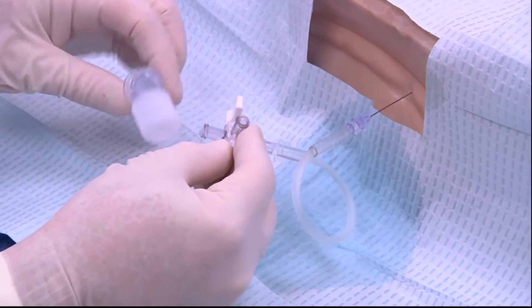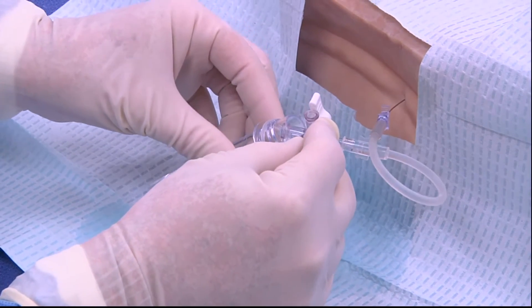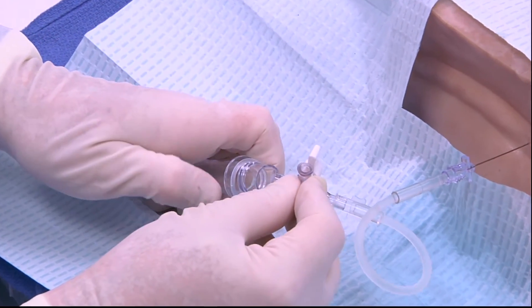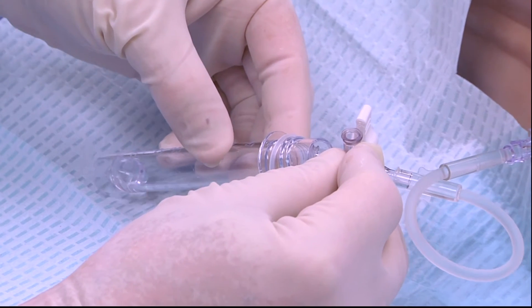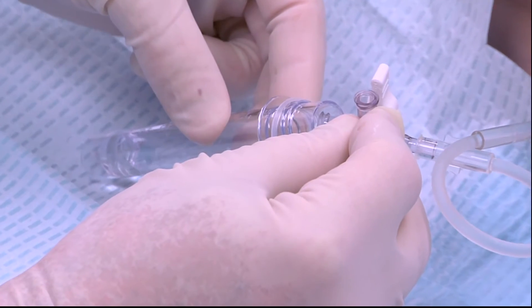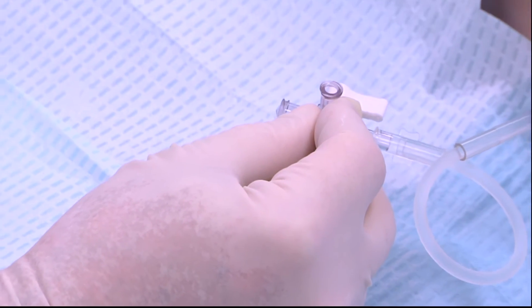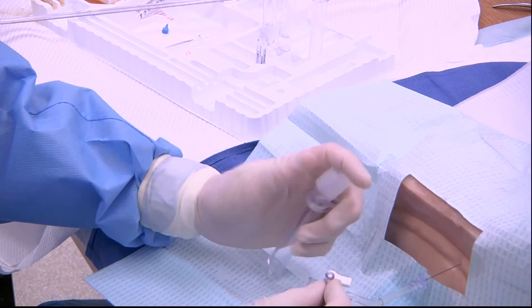Now it's time to collect the four test tubes with cerebrospinal fluid. Usually we put a CC or two in each test tube. The first and the fourth test tube are sent for cell counts. The second test tube is sent for chemistry so that we can get things like electrolytes, glucose, and protein. The third is sent for cultures and sensitivity for bacteriologic examination. The stopcock on the small piece of intravenous tubing helps us to manipulate the stopcock without worrying about affecting the lumbar puncture needle in place.